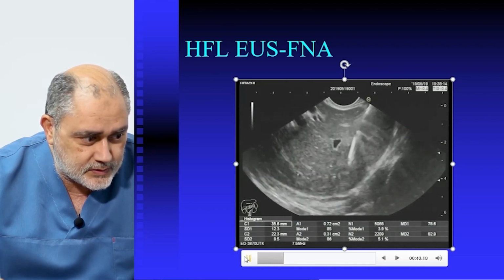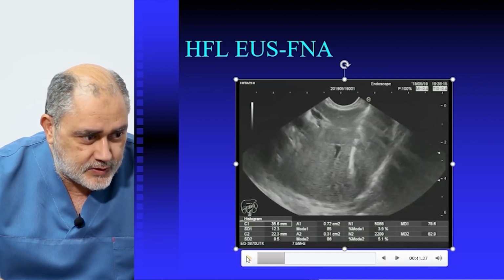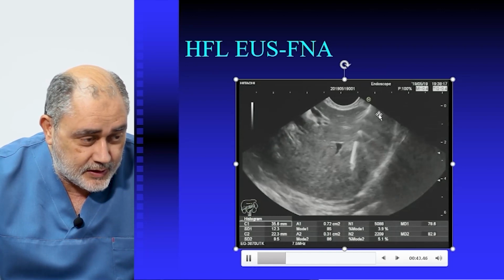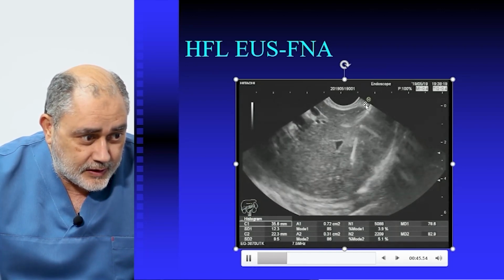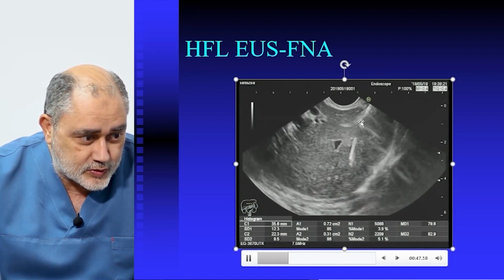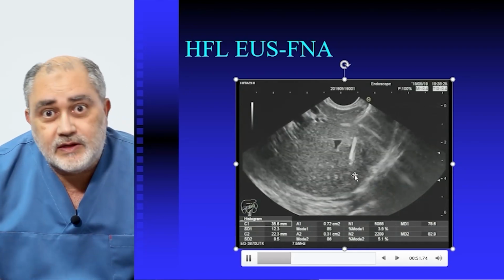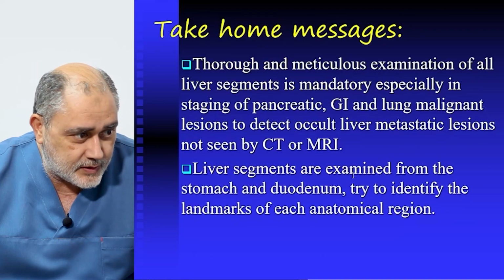So we can do it very easily. Also, this lesion is rather away from the echo endoscope, but very nicely and very easily and very safely we can do FNA from the liver.